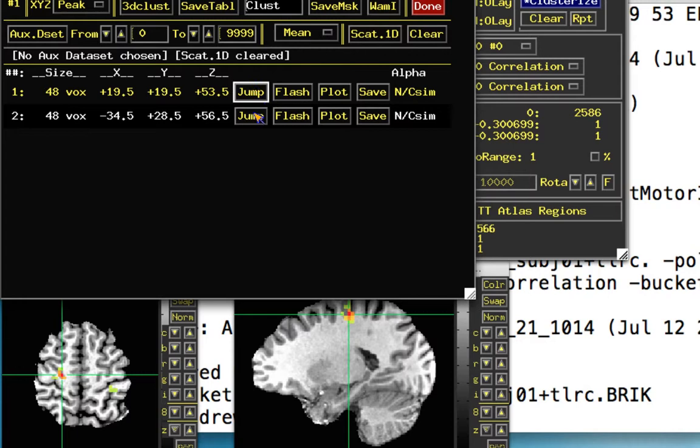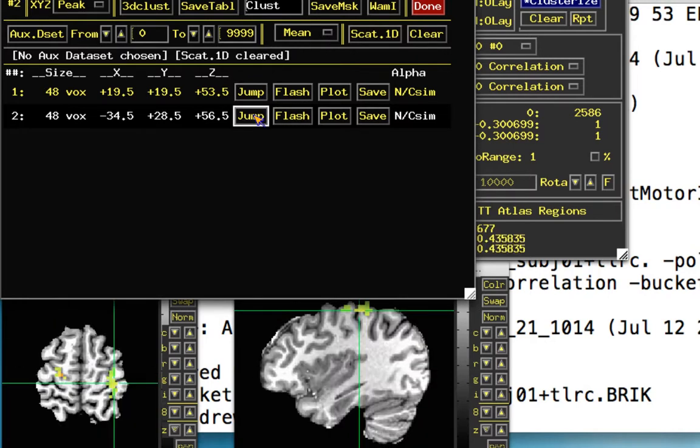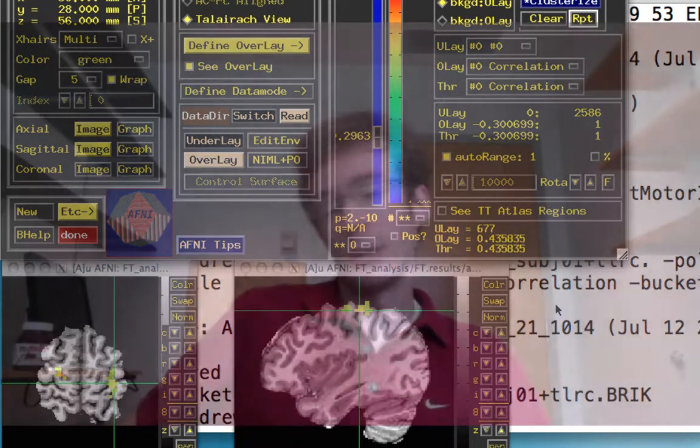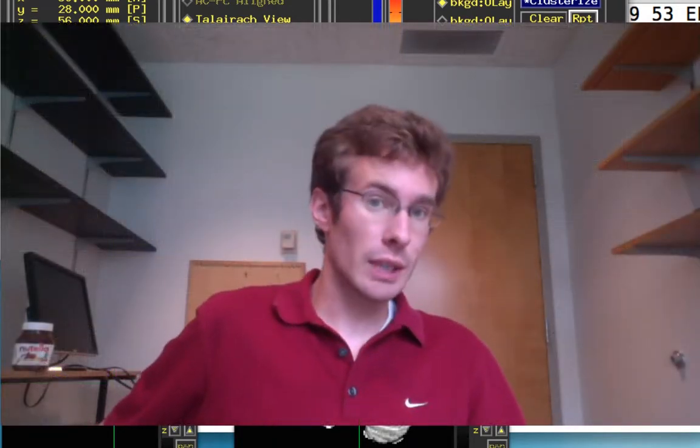But the idea is this correlation map reveals that there does seem to be some bilateral symmetry in the time courses for that seed region. So that's what a functional connectivity map looks like.